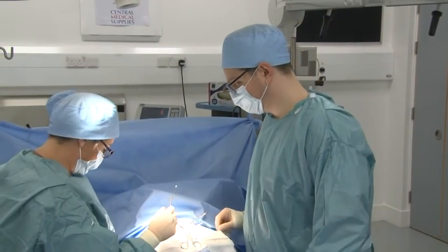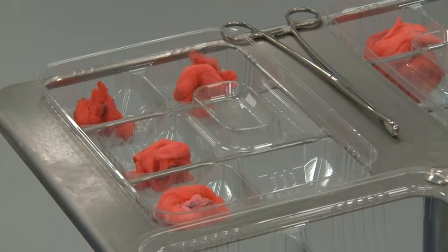Another important element of using Swabsafe is that it is a two-person check at the point of disposal of each individual swab. So the scrub practitioner and the circulating practitioner together are witnessing at that time the disposal of a single swab into the Swabsafe container and ensuring that that swab is placed directly into that section.